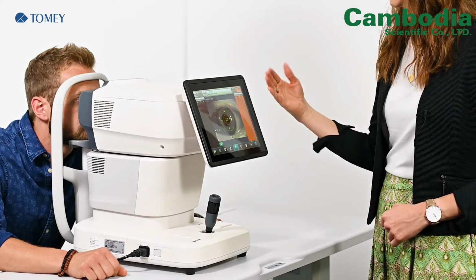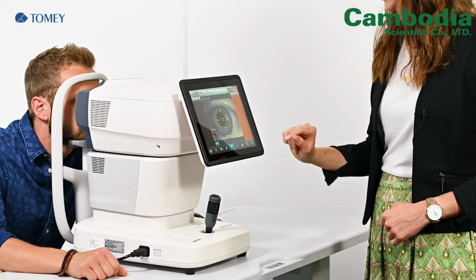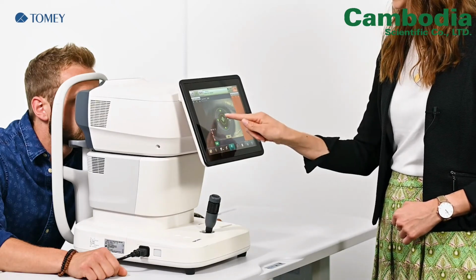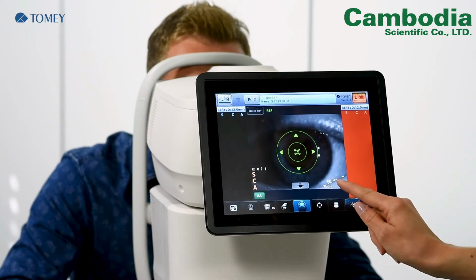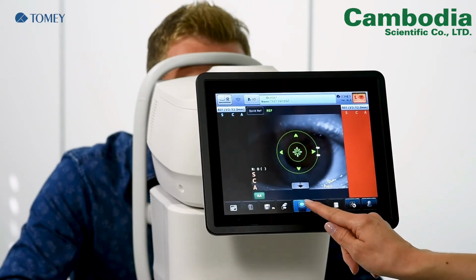First of all, we have to go into the focus, so touch a little bit in the display so you will see the blue cross. Now we are in the focus and start the measurement.